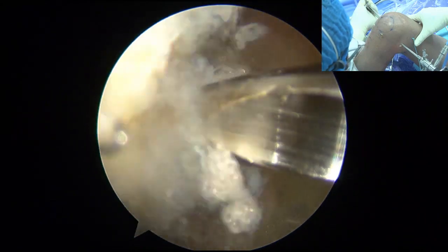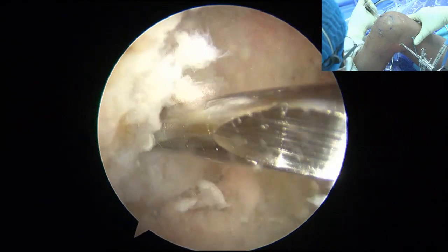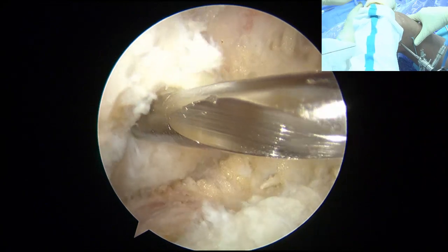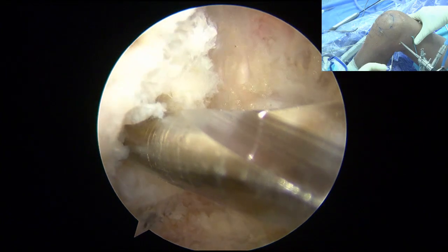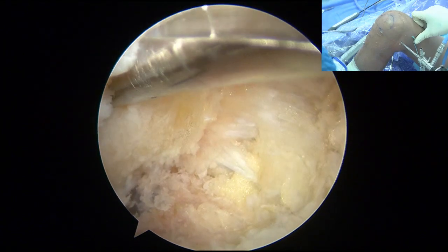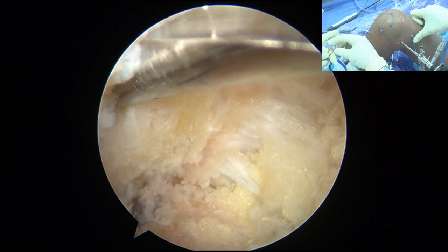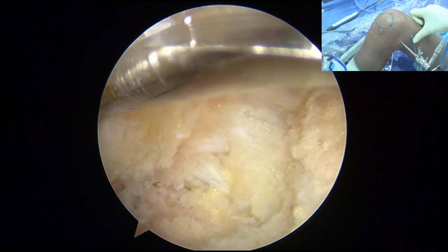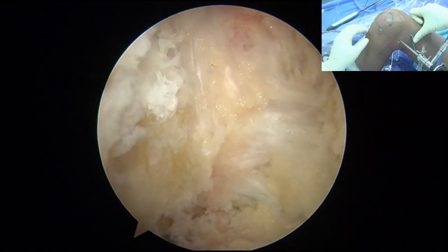Okay, good. Very good. Out, down. Voila. Suture. So then we pass the suture in. We use our suture. Ah, that's good. That's good. That should be fine. All right, now. So we take this pin out. Okay, suture retriever.